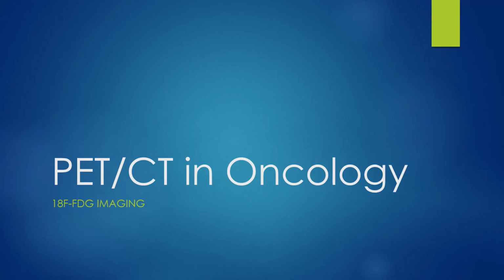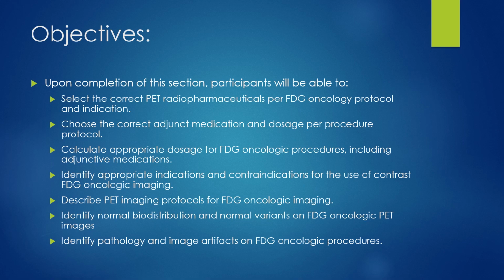Welcome to this video on PET-CT in oncology. This video will be divided into two parts. The first part will talk mostly about the protocols, and in the second part we will talk mostly about the images. Here are the objectives for this lecture.